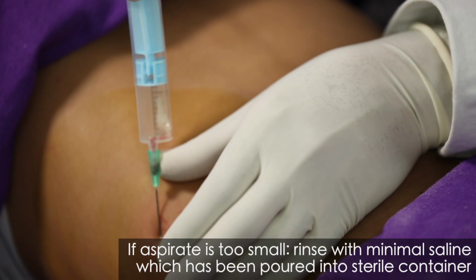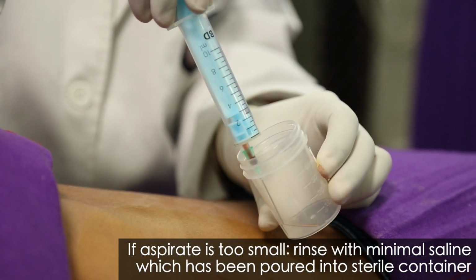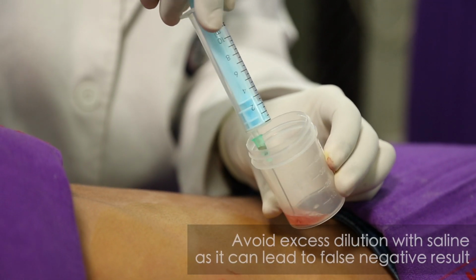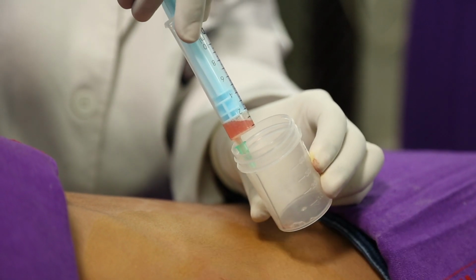If the aspirate is too small for transferring to container, then one may collect the material after aspirating and rinsing the syringe using minimal sterile normal saline. Avoid excess dilution with saline as it can lead to false negative result.